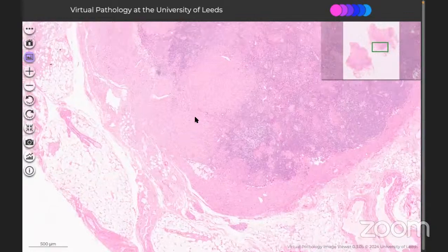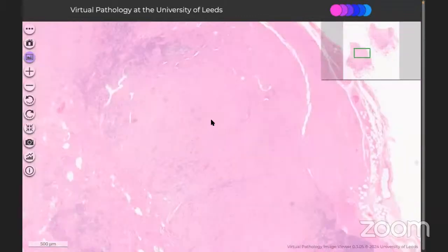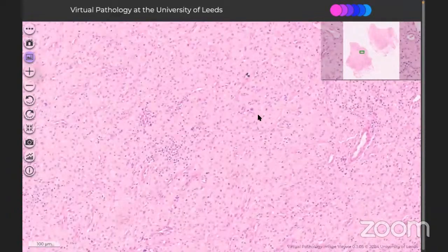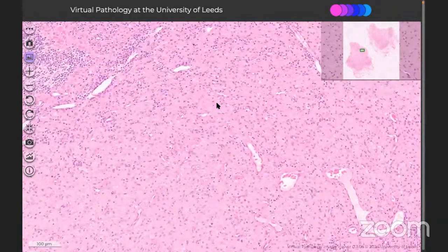Okay, so this is how, and you must put a differential of atypical tuberculosis, because in an immunosuppressed patient, atypical tuberculosis comes first. The typical tuberculosis will have some kind of necrosis within it, and the cells are more epithelioid, rather than this kind of foamy appearance of the macrophages, which is more seen in Whipple's disease in GI, if you remember. So this is how you work up this case.